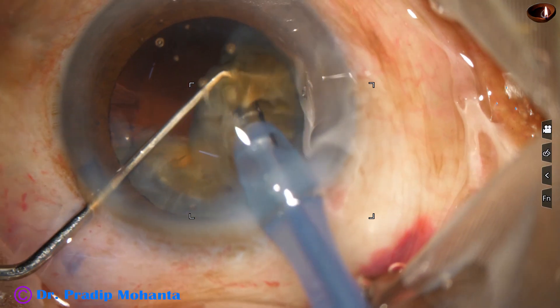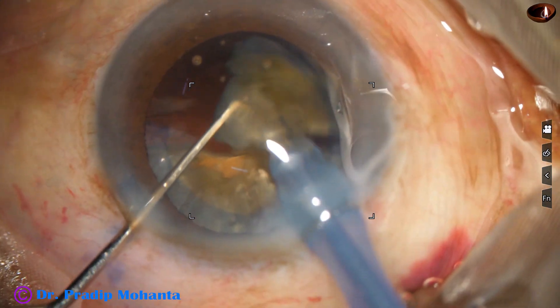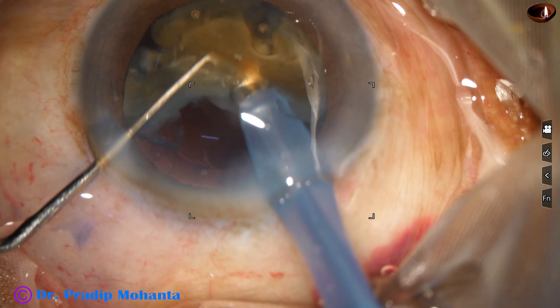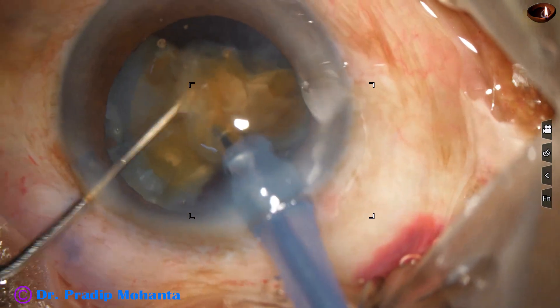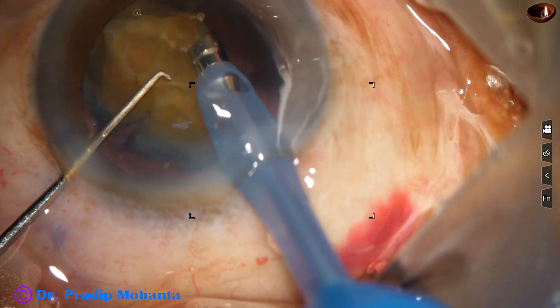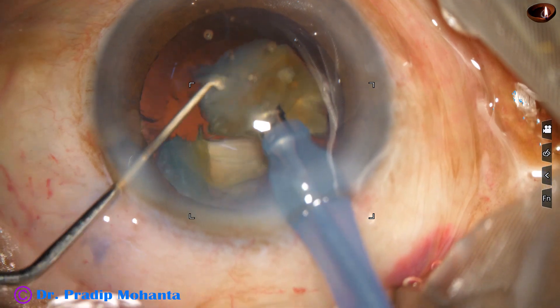This piece tumbled — divide it into two pieces and then emulsify. Now we are towards the end of the nucleus management, and there is no protective covering of the posterior capsule — no epinucleus, no cortex covering the posterior capsule.